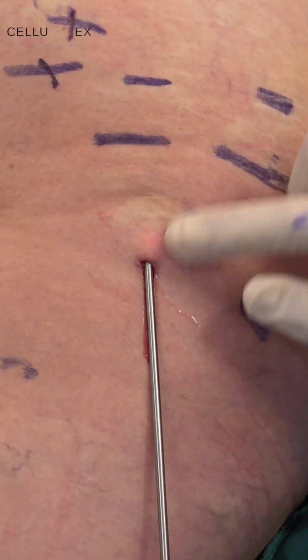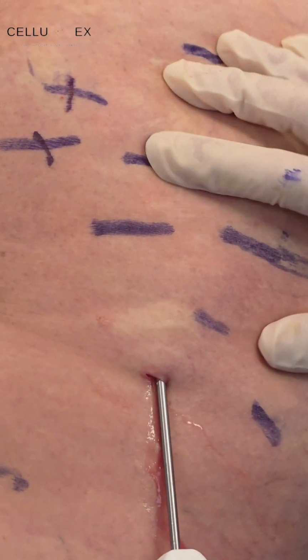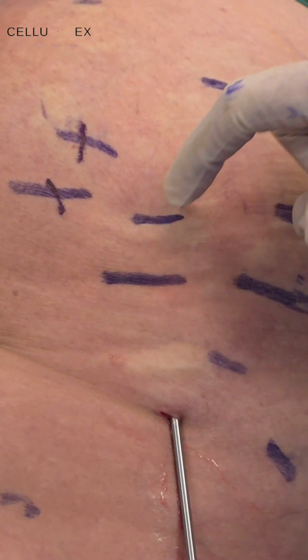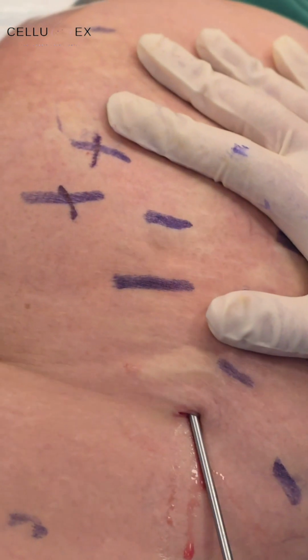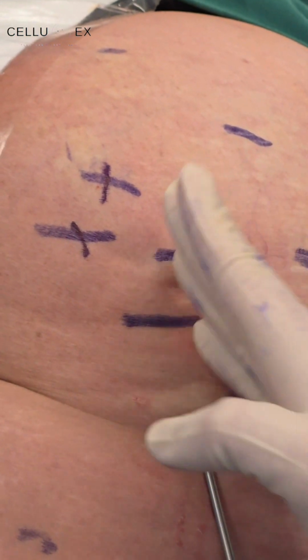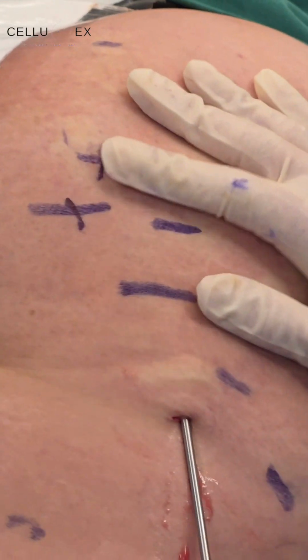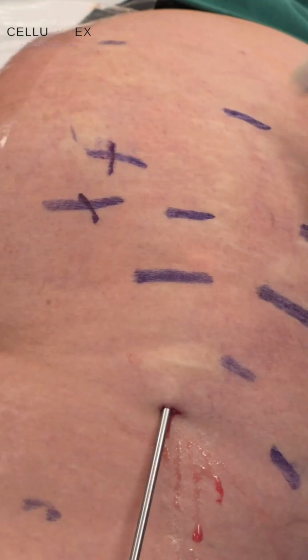So we'll go underneath the skin. You have a light source, it guides you through. So we'll go to this fibrous septum. So you see it is tethering the skin. I am holding it because I pressed. Now I'm gonna release it. This is done. So you have to go to the center, then lateral and medial. Now this is already released. We'll go to the next one.